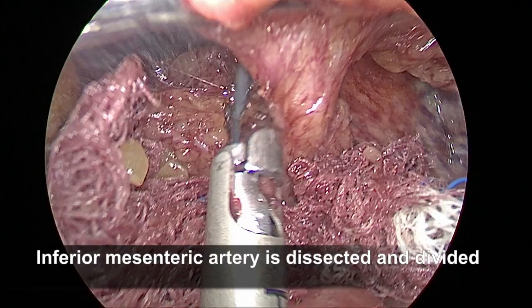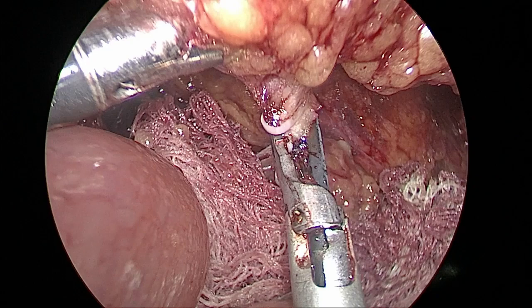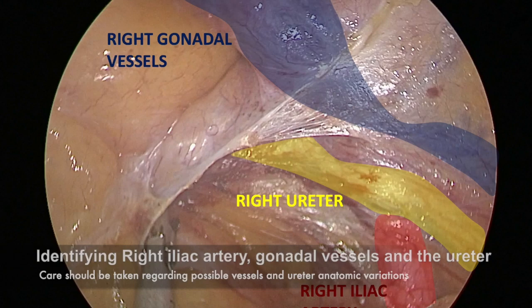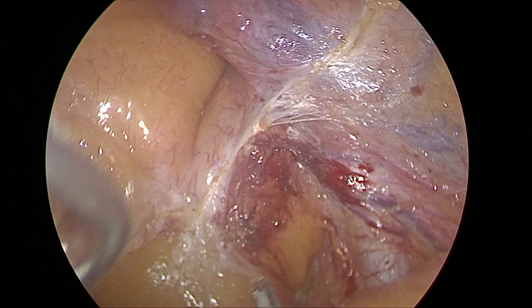In order to ensure proper lymphadenectomy, the inferior mesenteric artery is dissected and ligated at its origin. Toldt's line is dissected cranially to caudally until the peritoneal reflection is reached. At this point, we identify the iliac artery, the ureter, and the right gonadal vessels. Caution must be exercised, as anatomical variations may be encountered.